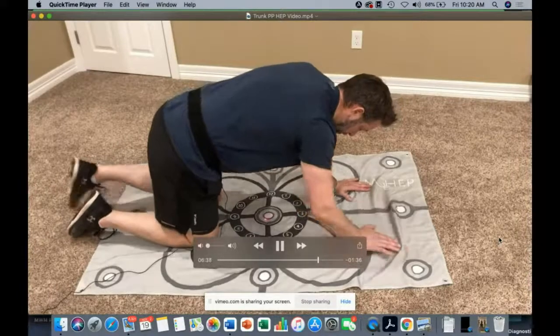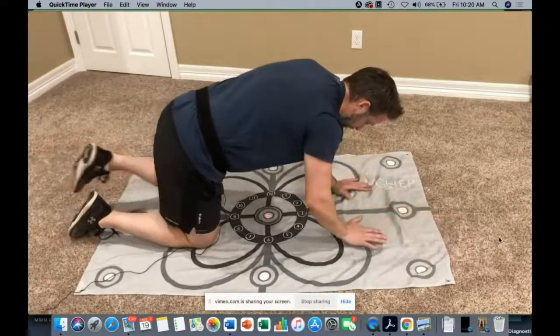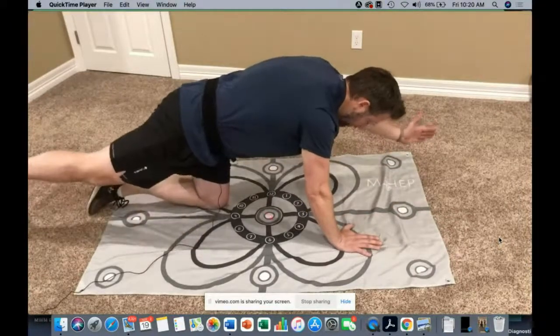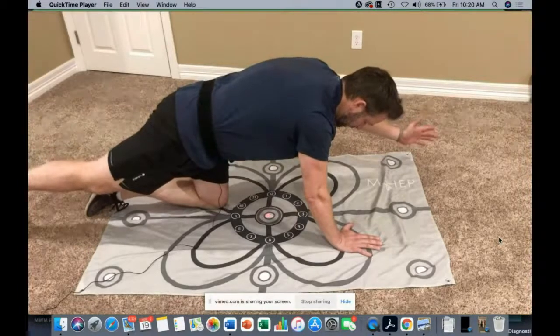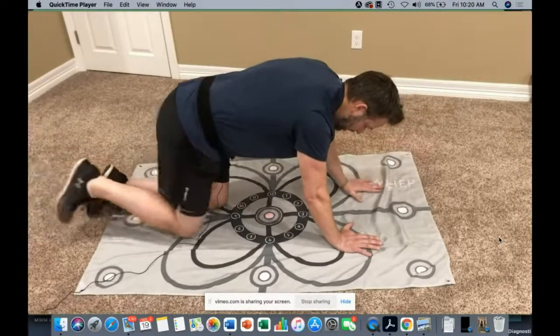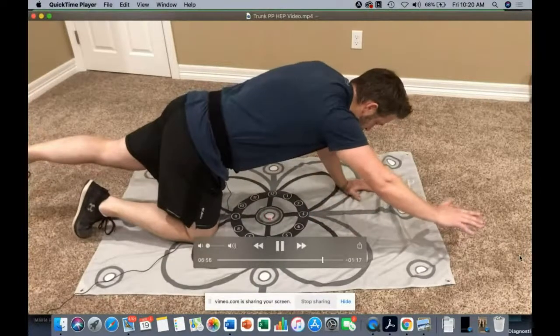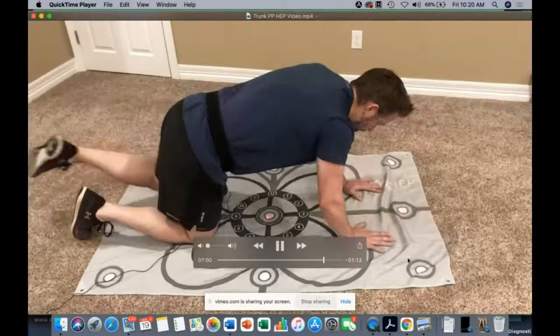And of course, again, you can have them go through certain numbers on the target. You can give them math to go along with that for some cognitive overlay. It can be a nice additive for engagement and motivation for your patient while they're doing this activity. Or have them start crawling. This is a great pediatric activity if you're working with any pediatrics.